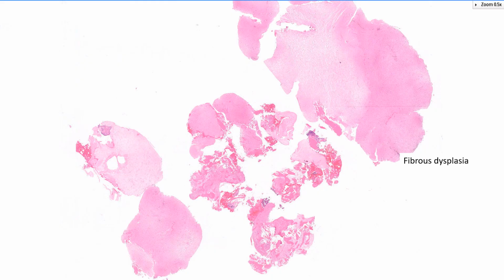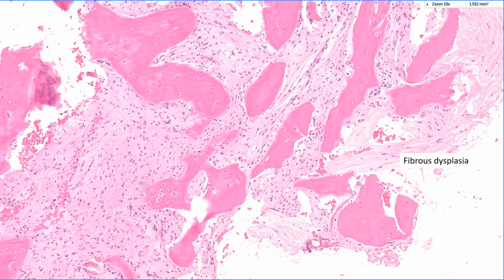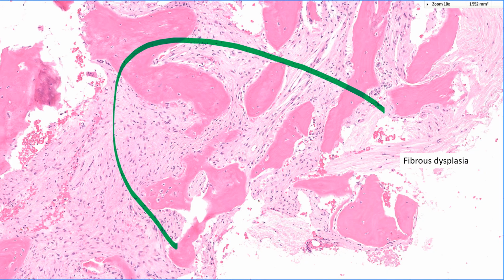So here's another example. This example wasn't particularly cystic, but when you look at this under low power, it's almost devoid. It's all lesional tissue, but it's devoid of those bony trabeculae, except for areas like this. There were areas, however, in this case that were pretty classic for fibrous dysplasia, right? We all agree that's pretty typical for fibrous dysplasia, and so is this, although the trabeculae are somewhat more thickened in this. But the bulk of the lesion looked like this with no bony trabeculae.